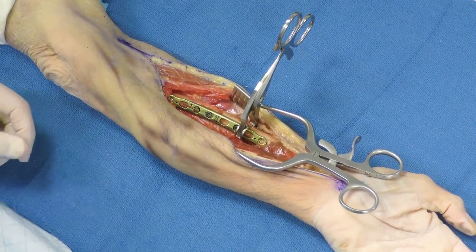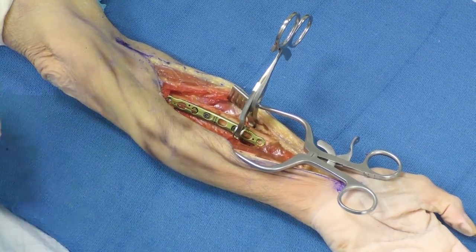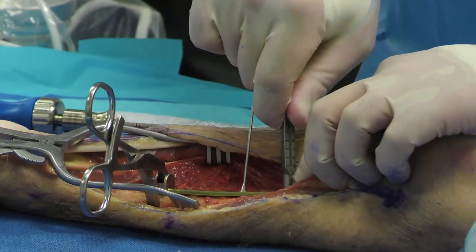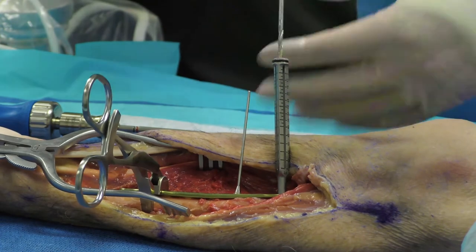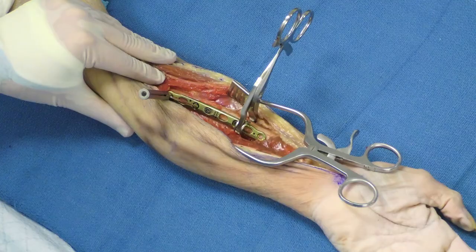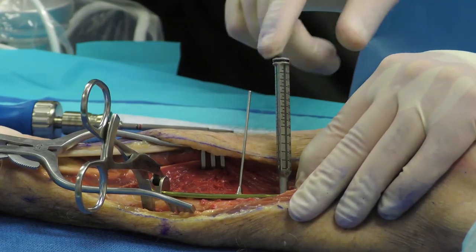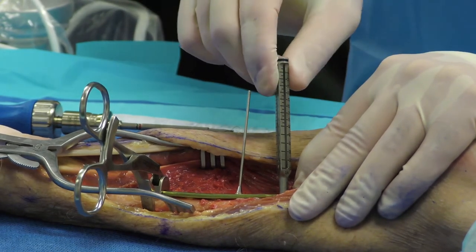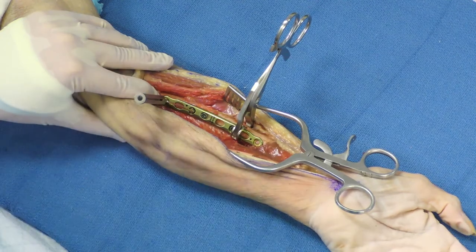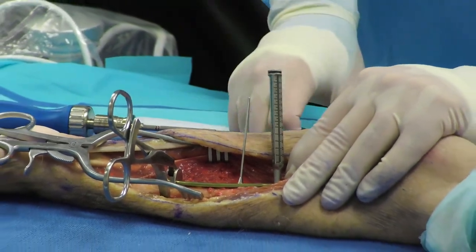If locking screws are necessary due to fracture pattern or bone quality, the same 2.8 mm drill bit is used for both locking and non-locking screws. This means if you're unsure whether you need a locking screw, you can place the guide tower and try a non-locking screw first. If you then need to switch to a locking screw because of comminution or osteoporotic bone, you can do so without making a new drill pass.